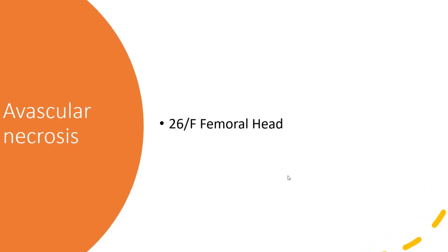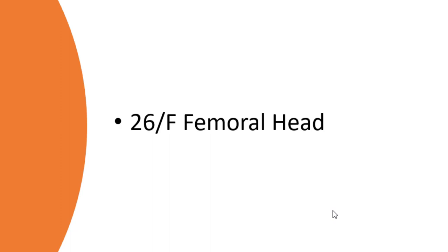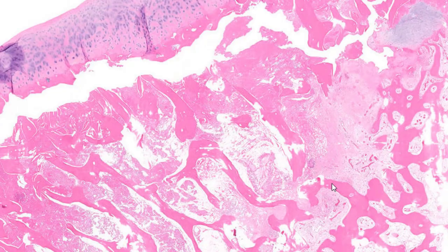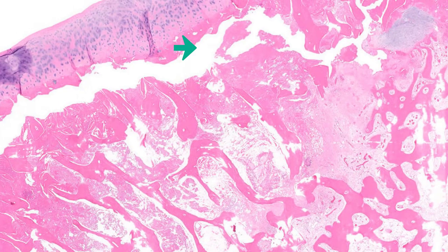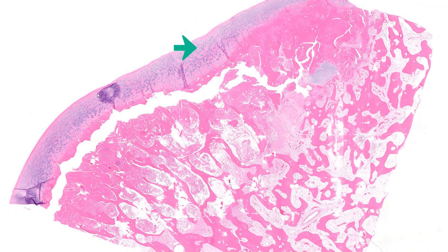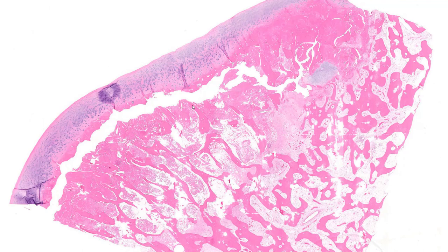Here's another case. This is a much younger woman, but again notice very similar features — those three layers. The top layer: the living cartilage. The subchondral bone is dead, and there's a crack between the subchondral bone and the rest of the bone right there. Then there's the interface, which is partially living and partially dead. And finally, the fourth layer, which is completely alive. Also notice this fibrocartilage, which is a healing response to the avascular necrosis.